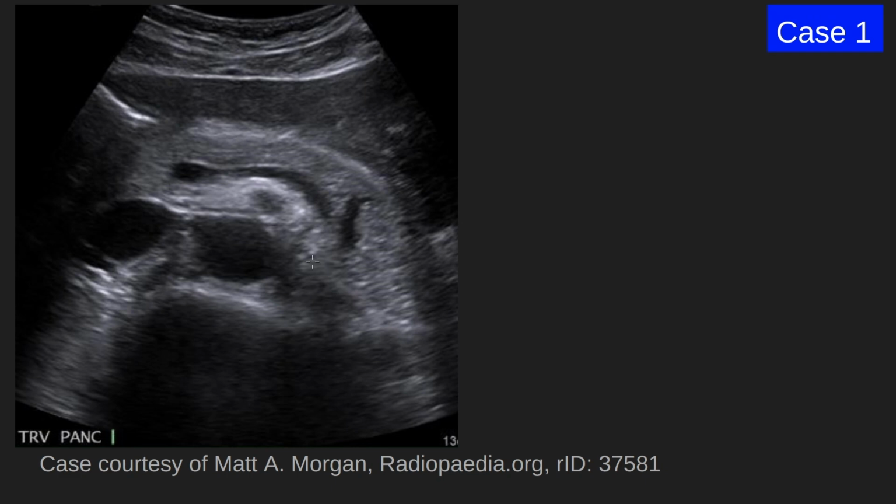Starting with the anatomy, this is an ultrasound exam trying to show the anatomy here. This is the anterior abdomen of the patient. That's where the probe is, and we are scanning anterior posteriorly. This shadow here is the vertebral body.